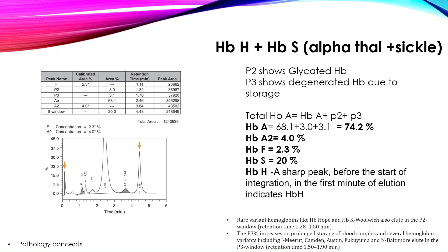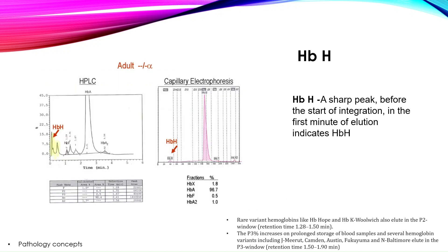HbH plus HbS — alpha thalassemia plus sickle cell — is a compound heterozygous condition. In this graph: HbA is 74.2%, HbA2 is 4%, HbF is 2.3%, sickle cell hemoglobin is 20%, and an additional peak called HbH is identified — a sharp peak before the start of integration in the first minute of elution — indicating hemoglobin H.